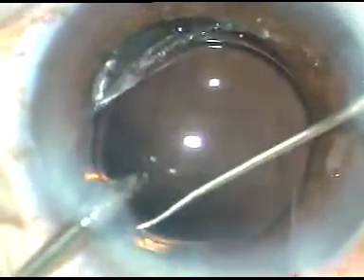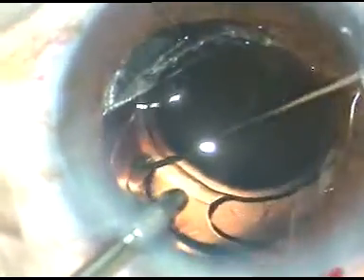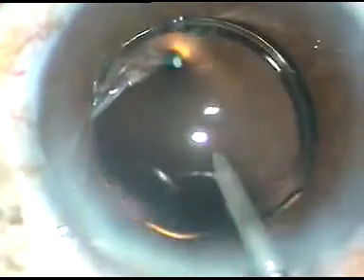In this case, we have selected a hydrophilic acrylic intraocular lens. This patient belongs to our free category service and we use hydrophilic acrylic intraocular lenses for these patients. These are very good lenses. The only thing is the PCO rate is high, but the lens remains clear. There is no issue of glistenings or microvacuole formation inside the lens.